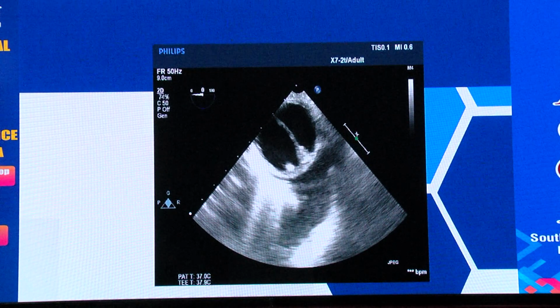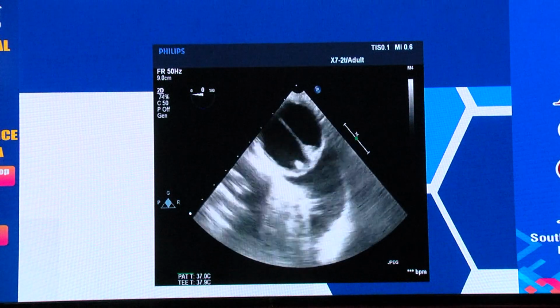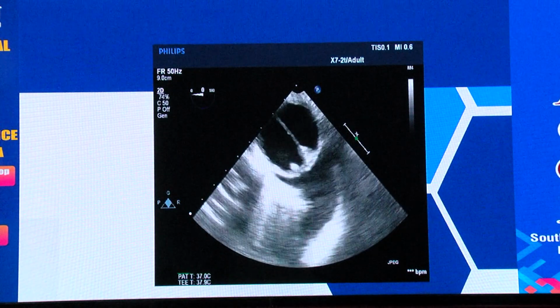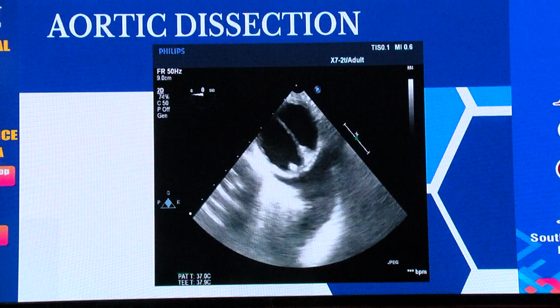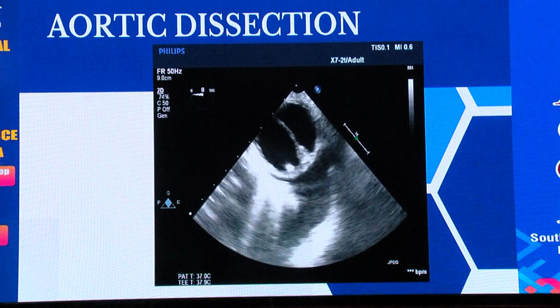The patient is going to have a slow pulse, a steady pulse, then he loses the pulse, then a rescue TE comes, and you put in the probe, and this is what you see. What do you see? You see the aorta, the descending aorta. You see an aortic dissection, which is a dire emergency, and you lose 1 hour.